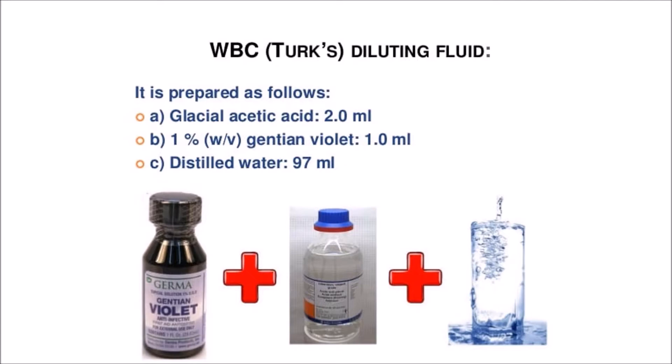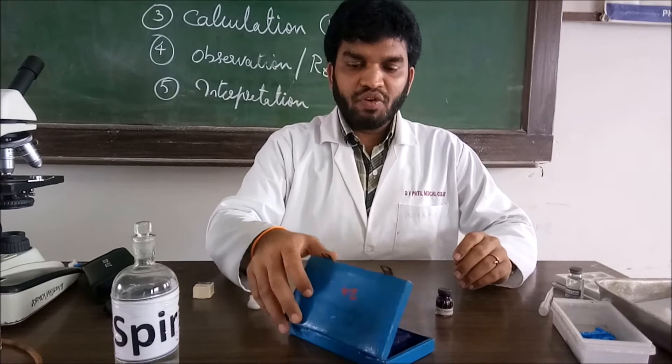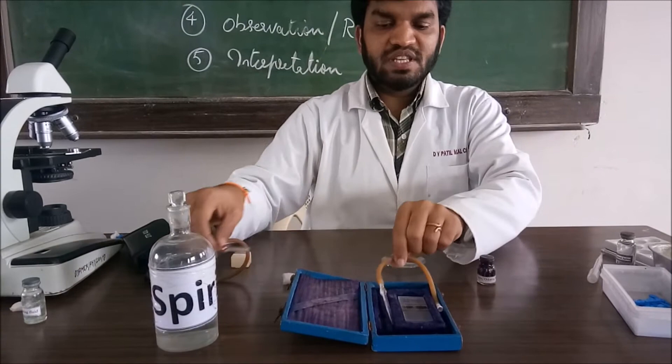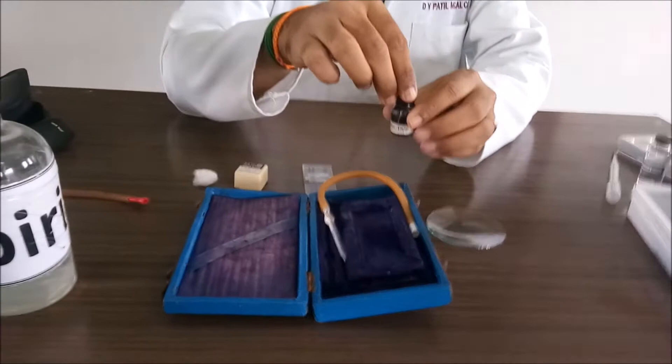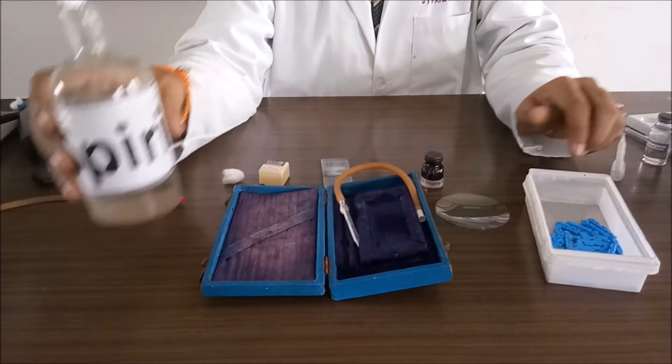For WBC count we require hemocytometer. If you open the hemocytometer, there will be a RBC pipette, WBC pipette, Neubauer chamber, cover slip, watch glass, WBC diluting fluid Turk's fluid, aseptic lancet, spirit, cotton. These are the required materials. Keep it ready.